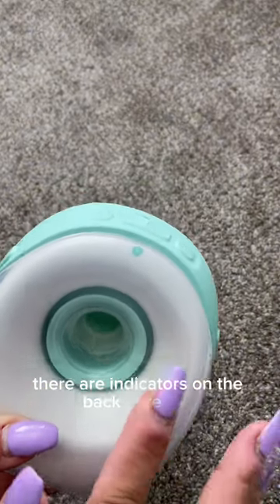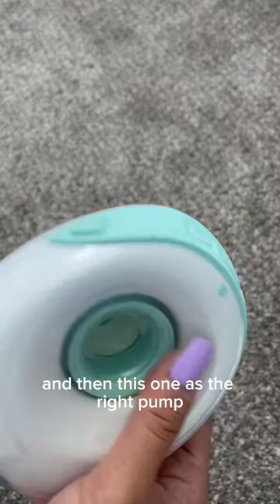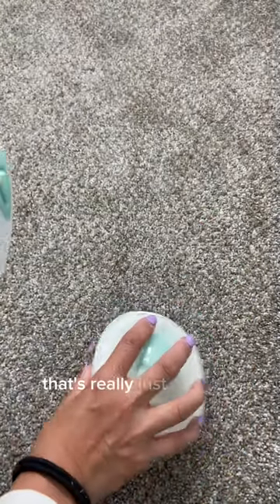There are indicators on the back that designate this as the left pump and this one as the right pump, but really that doesn't matter — that's just for your own knowledge.